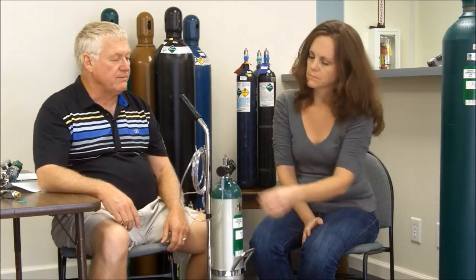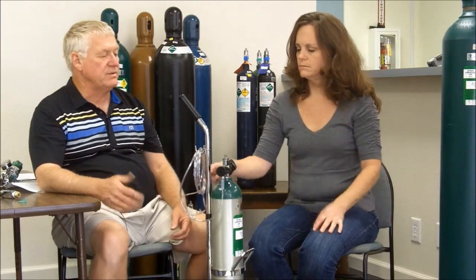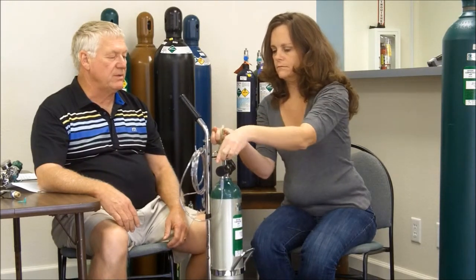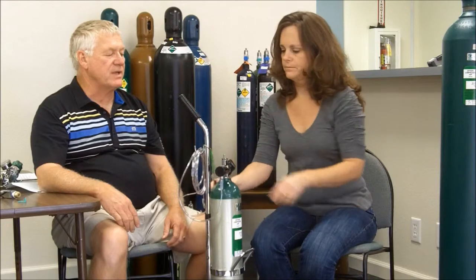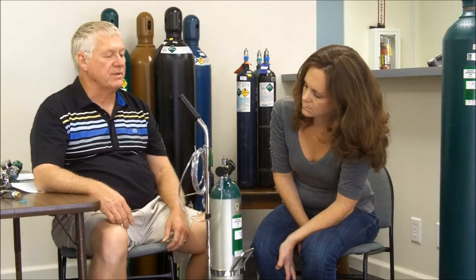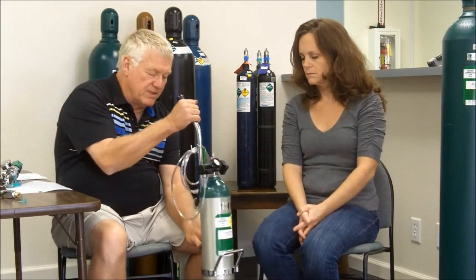Go ahead and turn it off to the zero position. I like to store my cylinders in the off or neutral position. So before leaving the cylinder, make sure it's turned off — take the slotted end of the wrench, put it on top of the cylinder, and rotate it clockwise until you can't turn it anymore. You shouldn't have to over-tighten it. When it comes to a stop, turn the flow control on and you should see the contents gauge go down to zero. When it's all the way down to zero, turn the flow control back to the zero position. Now the tank is in the off and safe position.